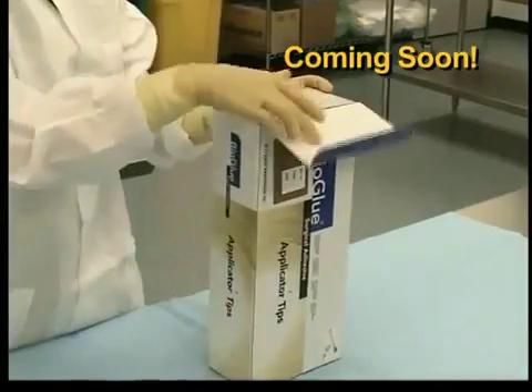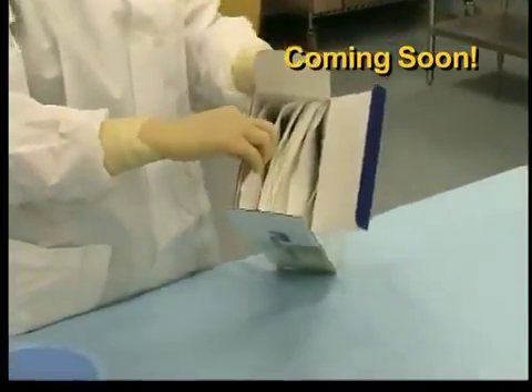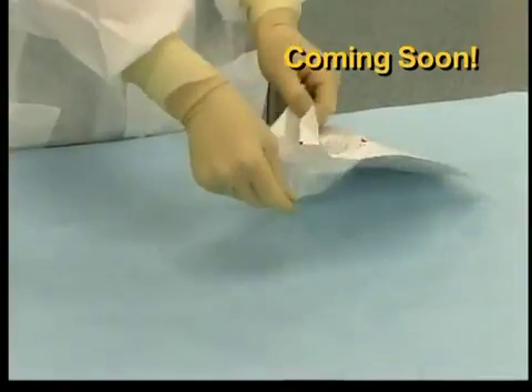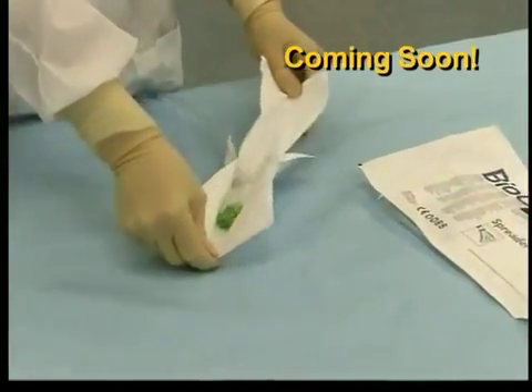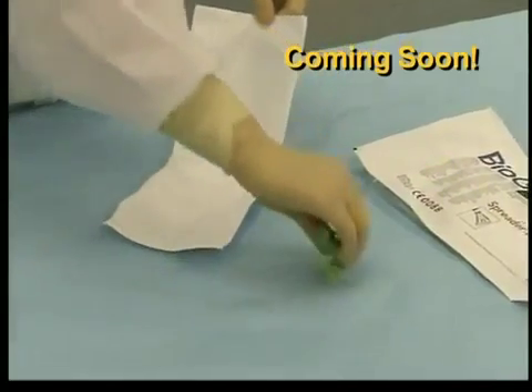Inside the outer shelf box, you will find 10 spreader tip pouches. Again, note the spreader tip indicator label on the front of these pouches. All of the spreader tips are fully disposable and double packaged such that the inner pouch and its contents are sterile. Three tips are packaged per sterile pouch.